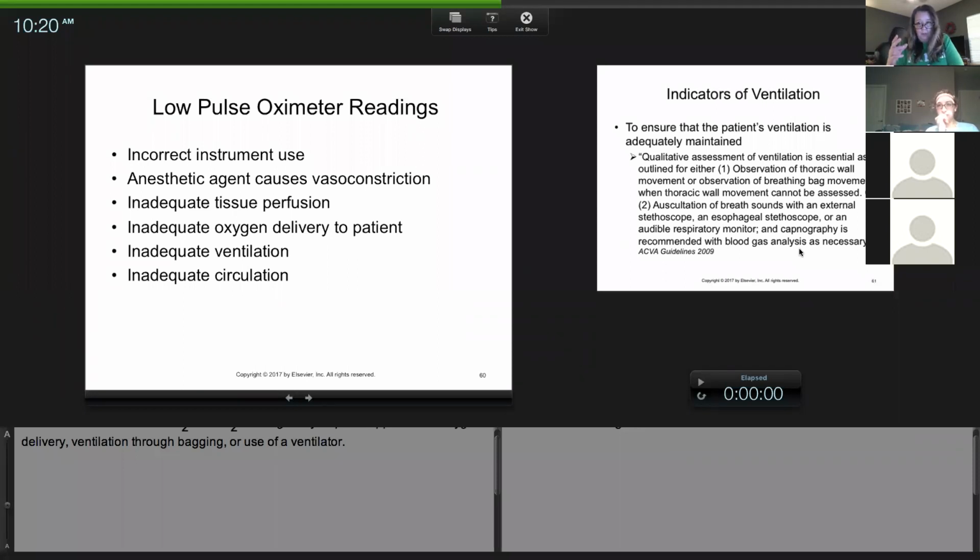So the first thing I went to do was, I thought his tube was clogged. He was a 6-year-old lab getting ear radiographs or skull radiographs. So I'm like, okay, maybe he got a mucus plug. There's a little cuff that you fill up on an endotracheal tube, and it has a little valve. I had to deflate the cuff to pull the tube to put a new one in. And when I deflated it, it shot the plunger of the syringe across the room. Like I just put it in, and it sounded like a pop.